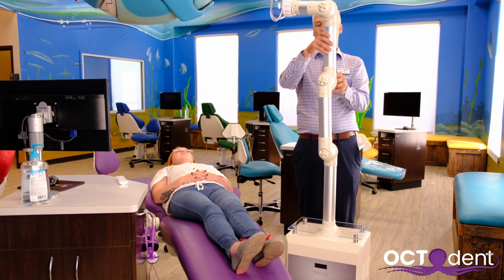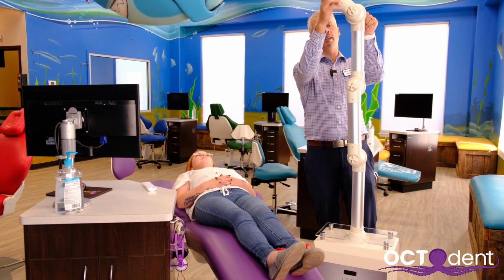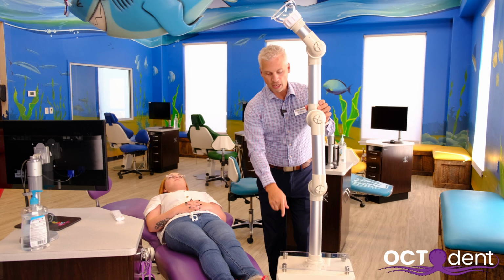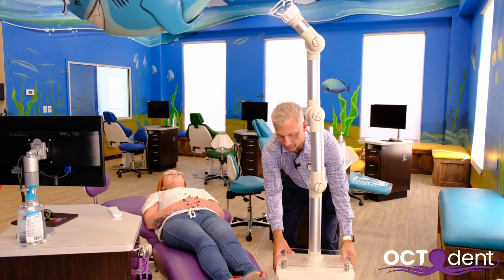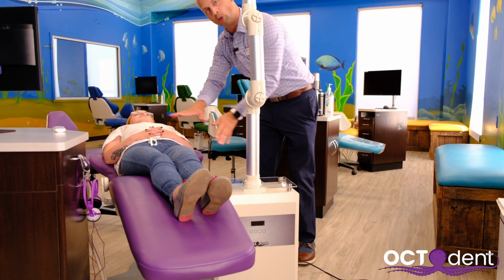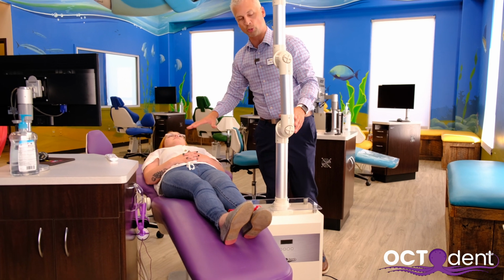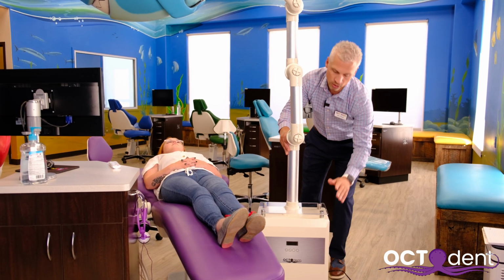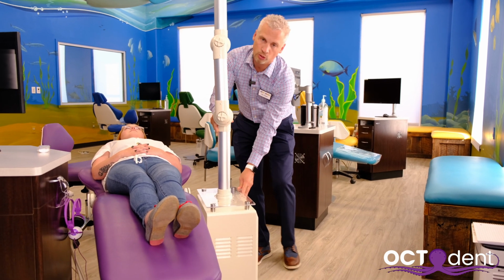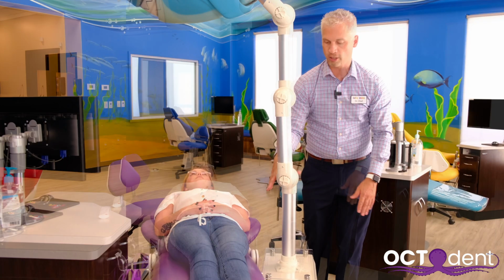So I'll have it positioned something like this, sitting in the corner of my operatory out of the way. Now if you notice, we have kind of a large base that this can hit into. I want this to be close to the patient, and that will allow it to be over top of the patient as much as possible. So I'll take the unit and turn it sideways like this, and line it up right around their waist, just below their waist, just right here.